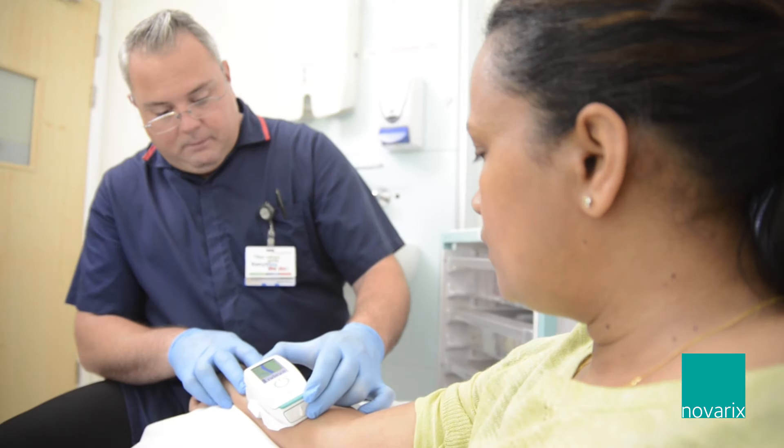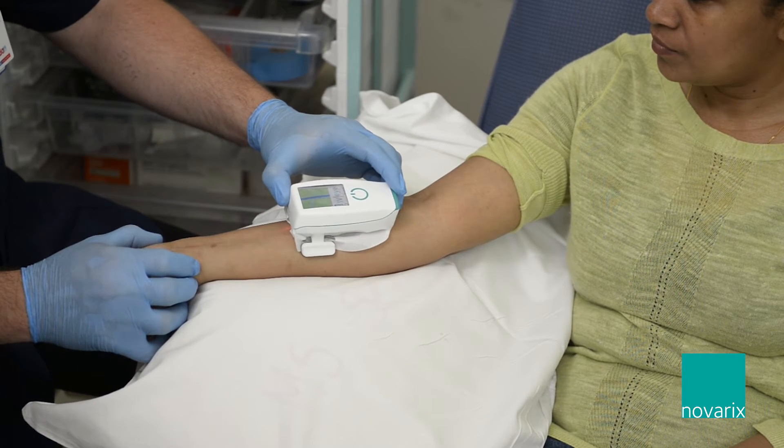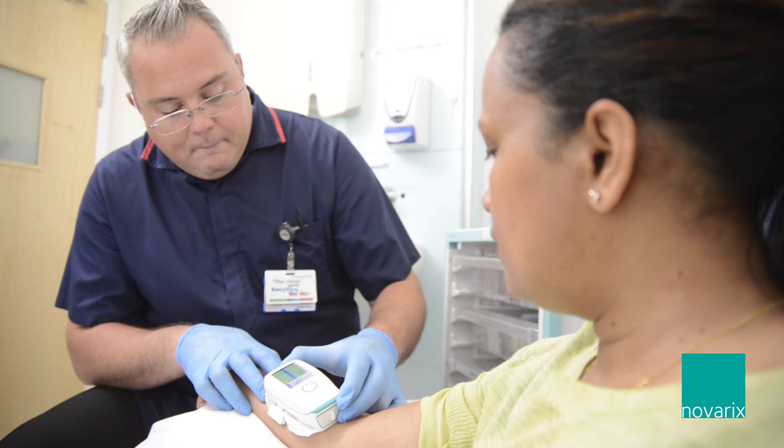Bariatric patients and patients with dark pigmentation skin also benefit, because the infrared technology means that we can see directly into the vein — it doesn't matter what the pigment of the skin is.